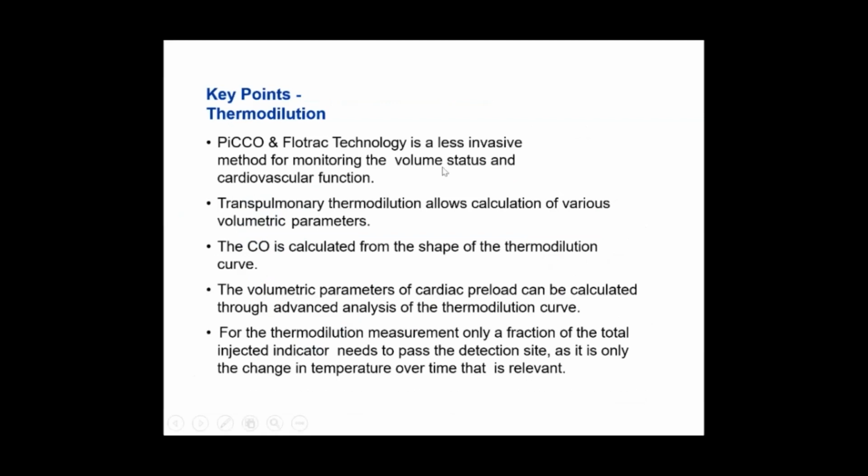PICO and FloTrac technology is a less invasive method for monitoring the volume status and cardiovascular function. These are some key points we have for revision. Transpulmonary thermodilution allows calculation of various volumetric parameters. The cardiac output is calculated from the shape of the thermodilution curve, and the volumetric parameters of cardiac preload can be calculated through advanced analysis of the thermodilution curve. For the thermodilution measurement, only a fraction of the total injected indicator needs to pass the detection site, as it is only the change in temperature over time that is relevant.